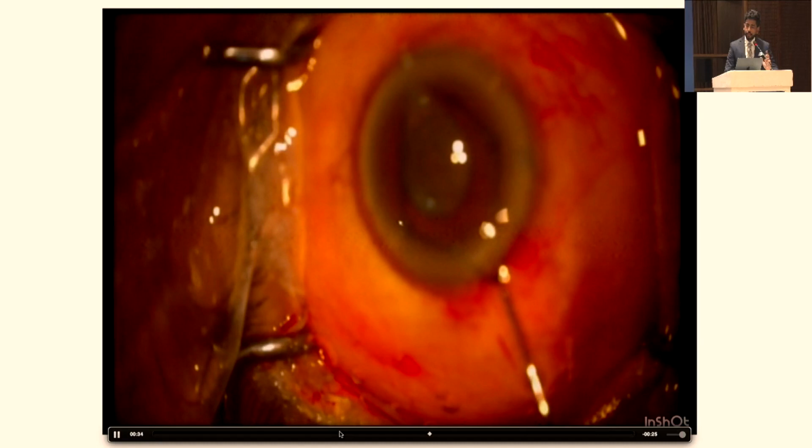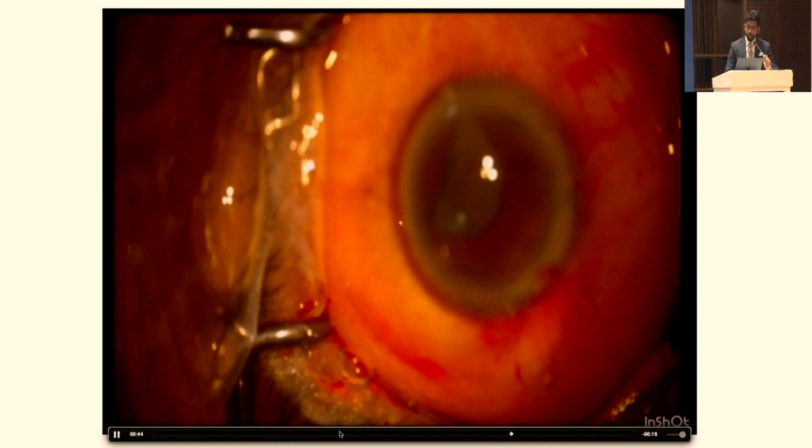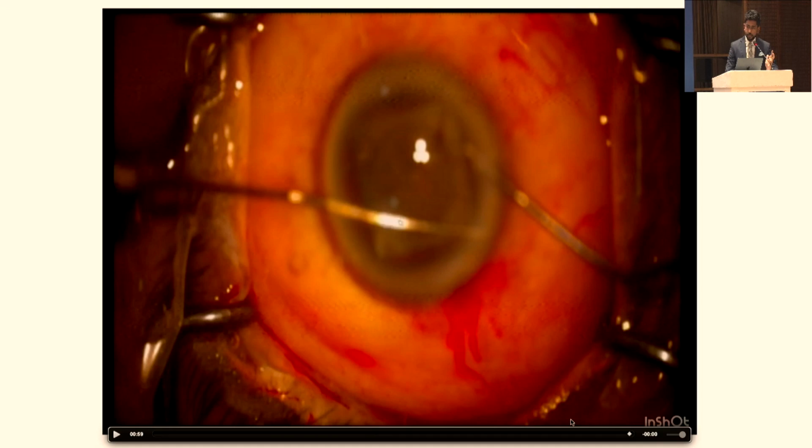For the other scrolls, make sure the first scroll goes underneath and the rest of the scrolls can be guided through using a second instrument, which could be a dialer, a Y-hook or a phaco tip or a phaco rod. As you can see, you can get a well-dilated pupil, after which you can proceed with either a phaco or an SICS.